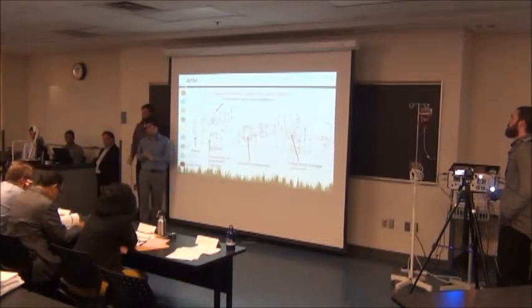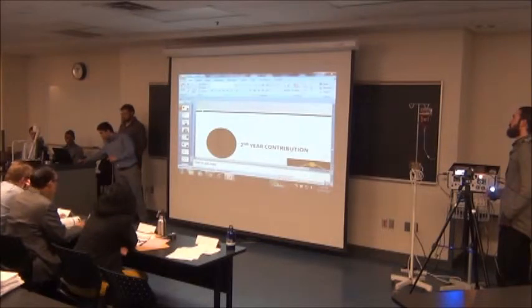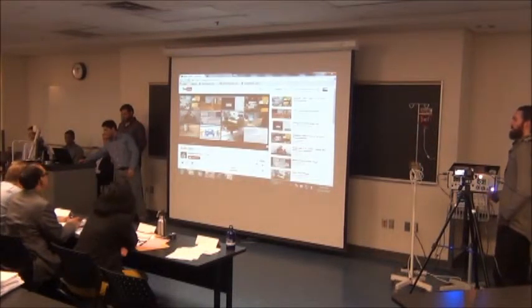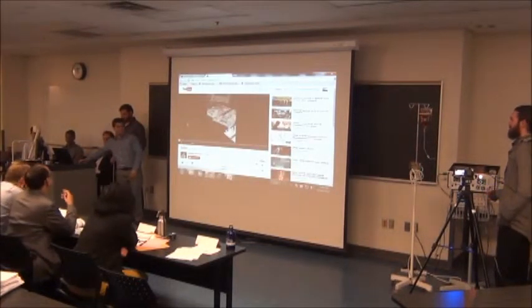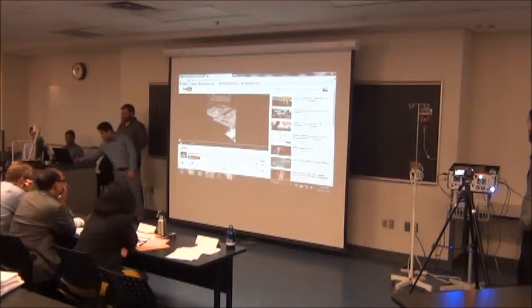So beats per minute, I have a video. We also have an audio, so we have like a big indicator, so you know that your heart is listening. And there's a small video I have here.